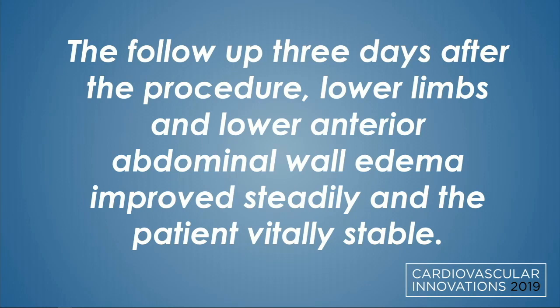Only edema. And do you know from the MRV whether this was tumor invading the IVC, or just compressing without invasion? Some people, of course you have the renal veins there, would advocate a covered stent if there was invasion of tumor. Do you recall if it was invasion or just external compression?